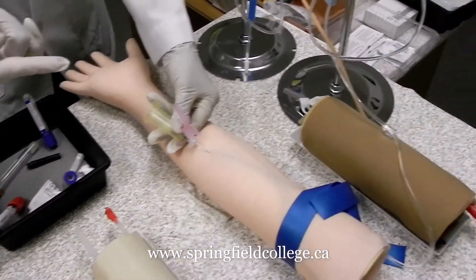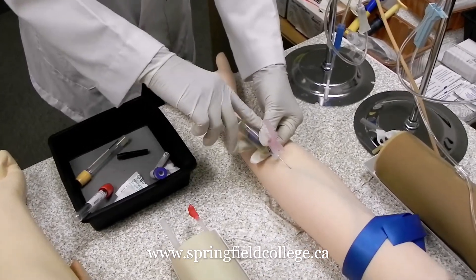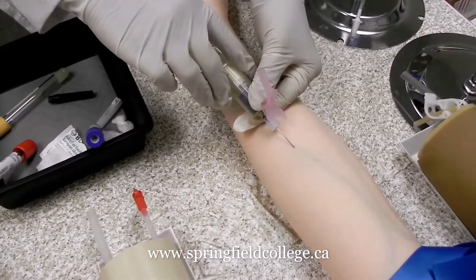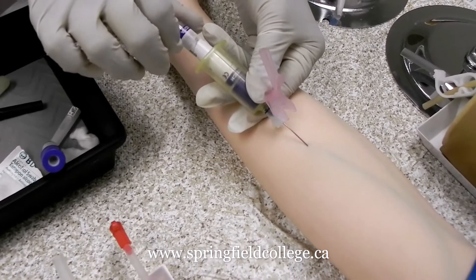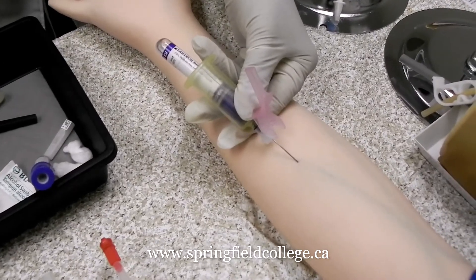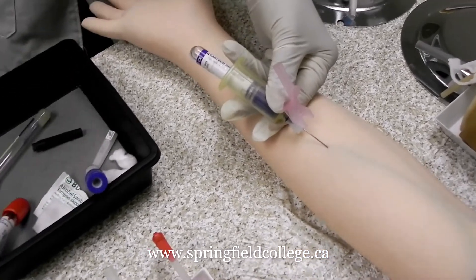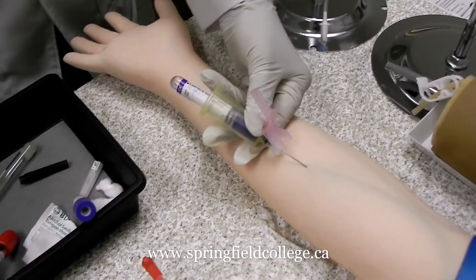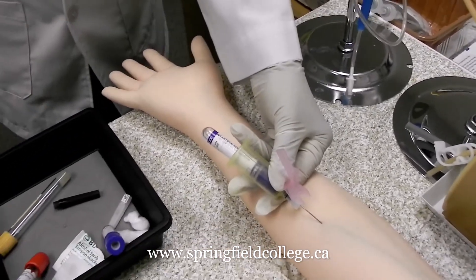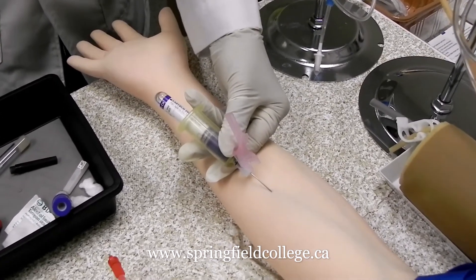For a multiple draw, you are going to take the next tube and insert it the same way — you can hear a little click sound as it collects. In a multiple draw you may want to wait to remove the tourniquet — not immediately. Depending on the number of tubes, you may wait until the beginning of the last tube, or if blood flow is good you can remove it after two or three tubes, depending on the number of tubes.